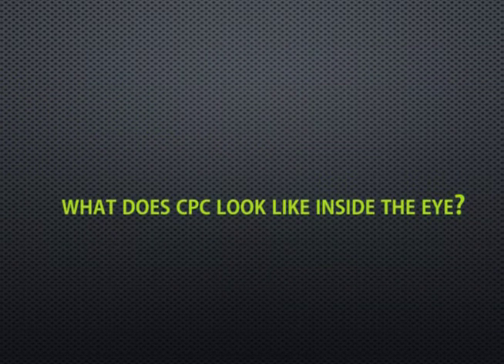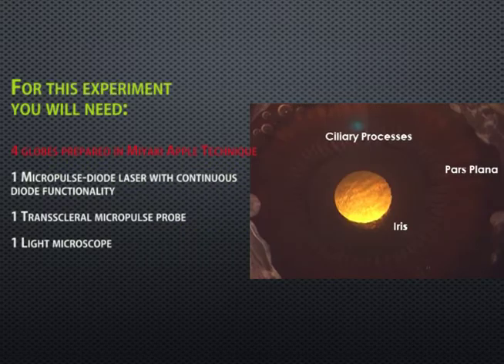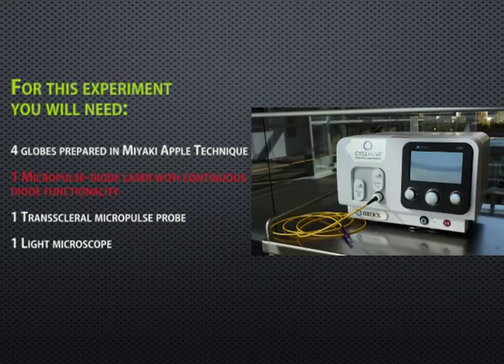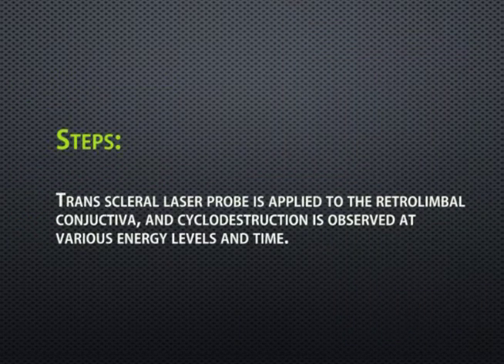Did you ever wonder what cyclo-photocoagulation looks like inside the eye, or which technique is safer — micropulse or continuous? For this experiment you need four globes prepared with a Miyake-Apple technique, one micropulse diode laser, and one transcleral micropulse probe. First, the probe is applied to the retrolimbal conjunctiva and cyclo-destruction is observed.